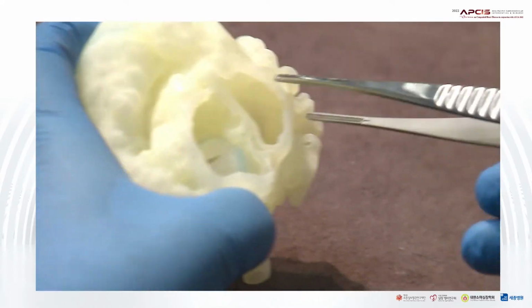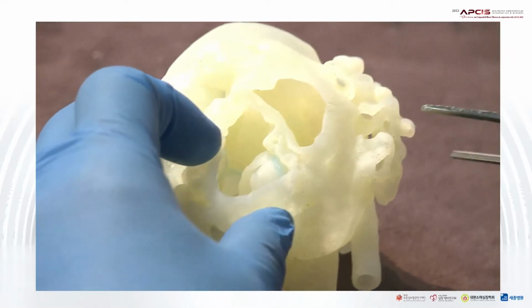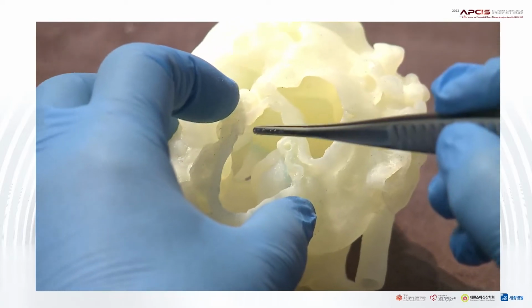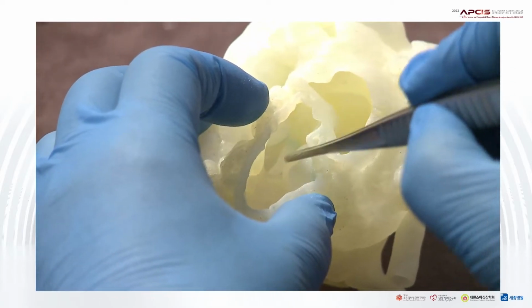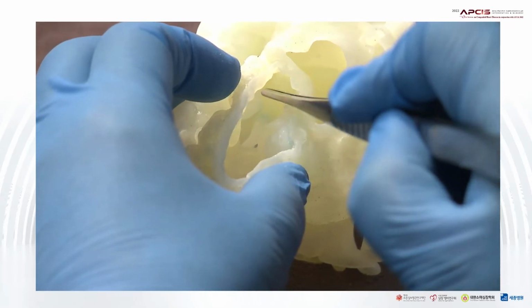And again, we see the left LV cavity. This is the mitral valve. So we cannot see the aortic valve here. The very large VSD here is the only outflow tract of the left ventricle.